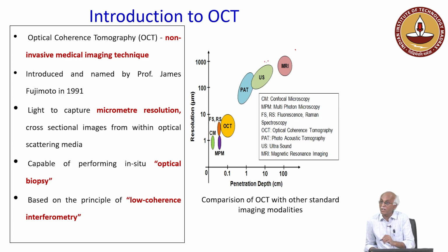So, that is with ultrasound. Then this is photoacoustic tomography, that also we understood. It is also possible to receive some information beneath the skin surface.